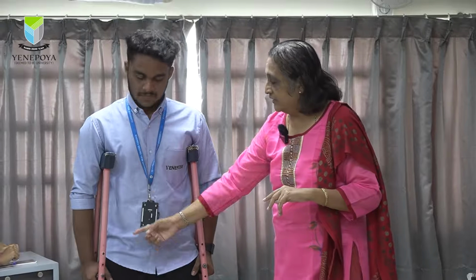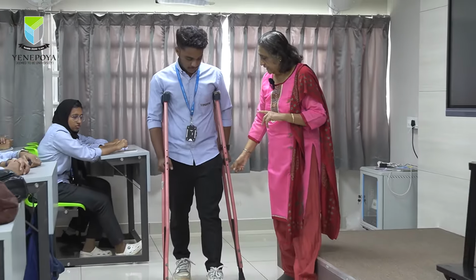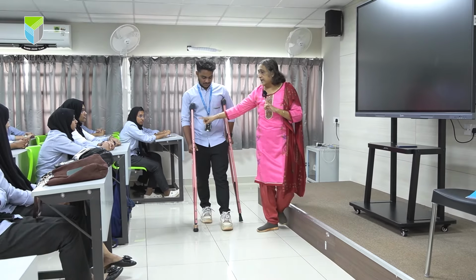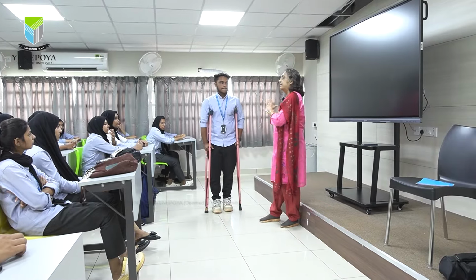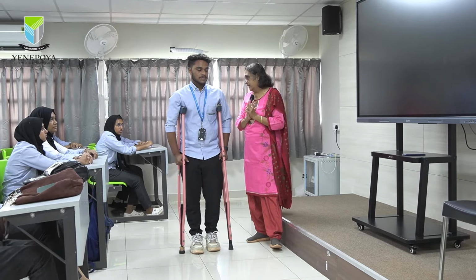When we are training the patient, one crutch will go forward, then the opposite leg will go forward, then this side crutch will go forward and that side leg will come forward. Why I am telling this is that the right leg with the left crutch, and after that the other pair, is the normal gait pattern of the shoulder and the pelvic, which go in alternate patterns. So the shoulder girdle and pelvic girdle always have the alternate pattern in the normal gait cycle.